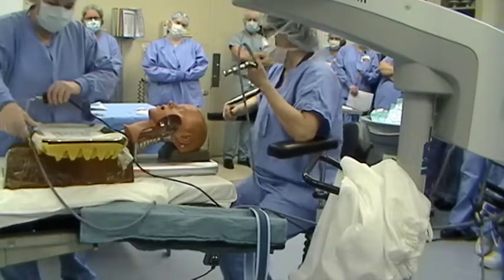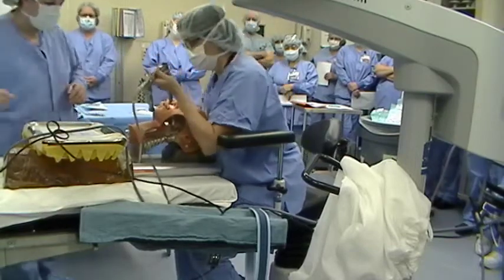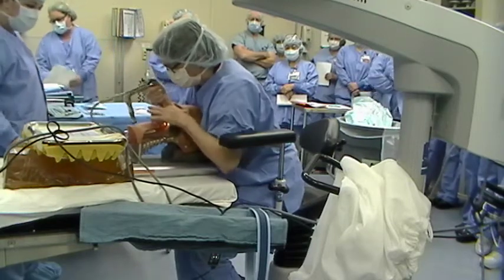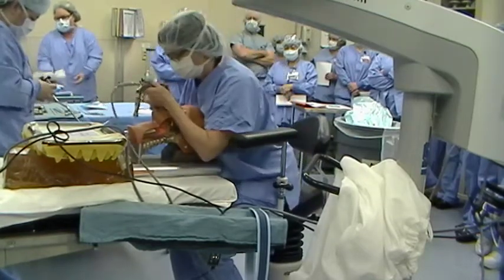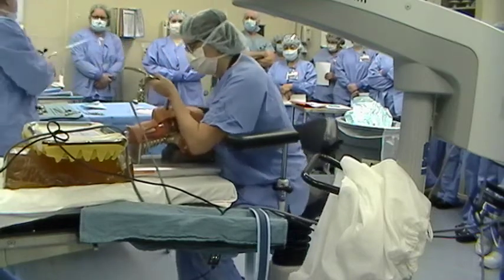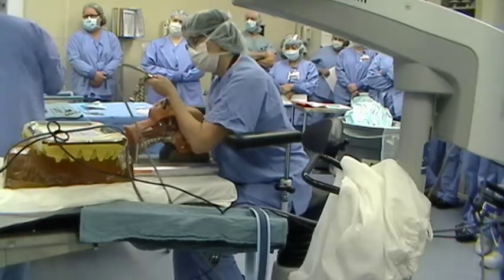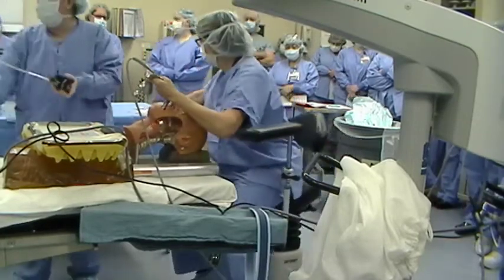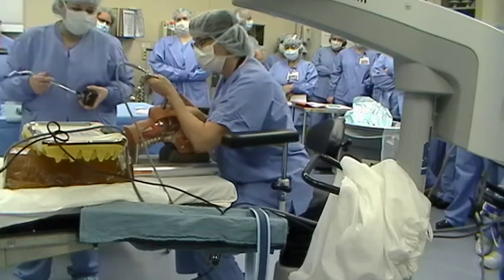I'm hoping I could get him intubated because he's really stiff. I'm not going to use the mouth guard because there's not enough room to put the scope in. When I'm putting the scope in, I'm going along the side of the mouth, pushing the tongue to one side. Anesthesia has their tube taped off to the left. I get the Louie ready — you want to make sure that you have the arm lifted up so it's away from the chest. You also want to make sure your screw is backed off all the way through your clamps so that you'll be able to slide it on.